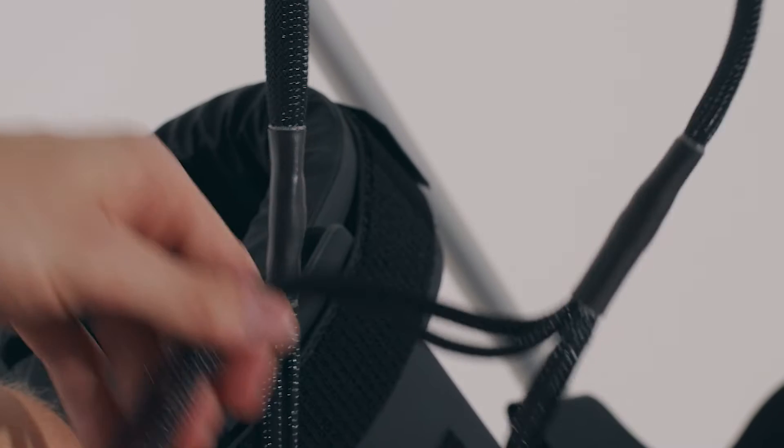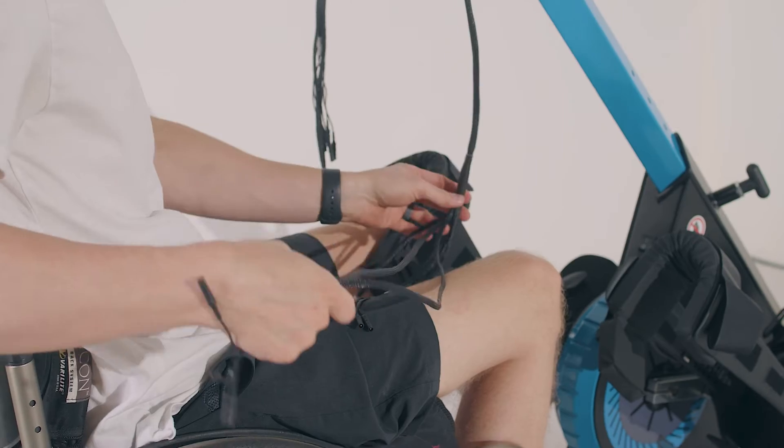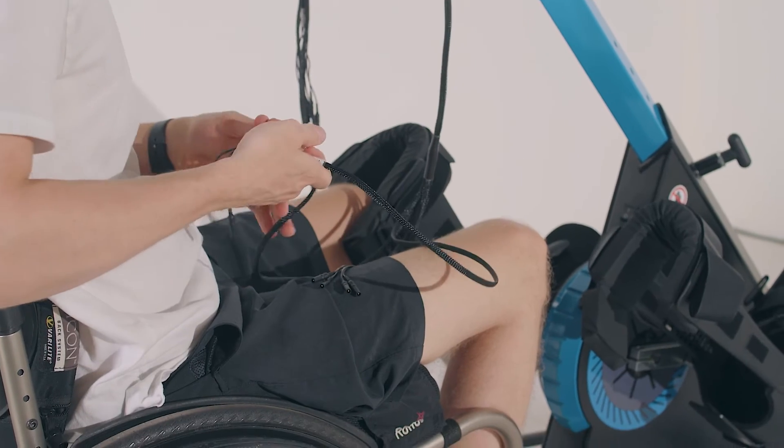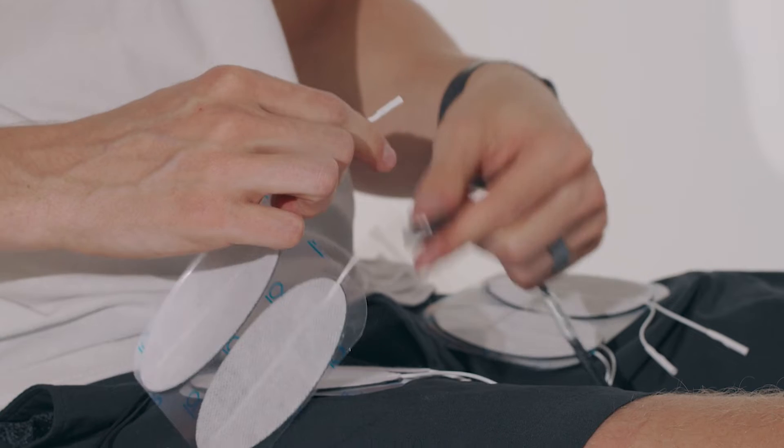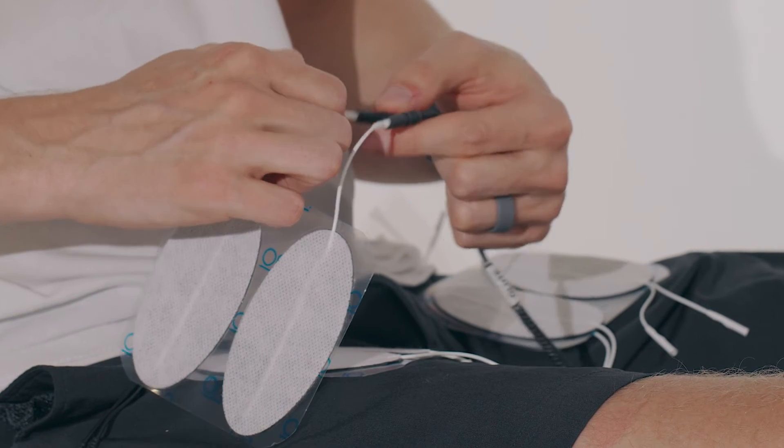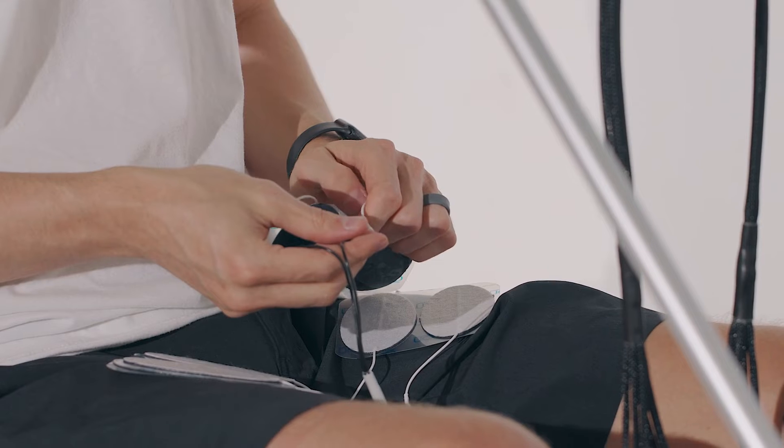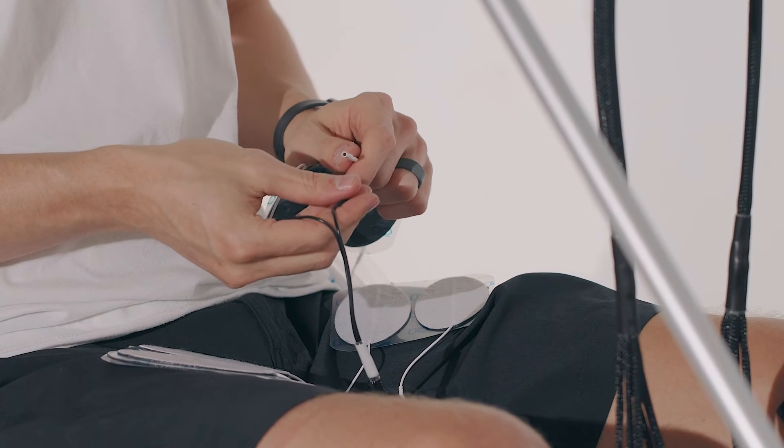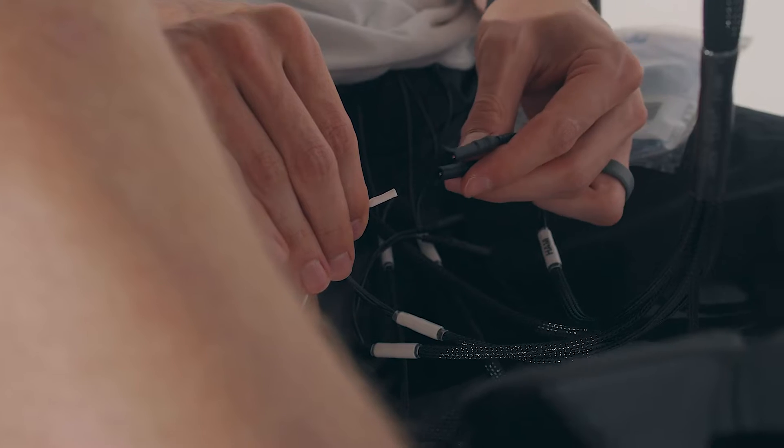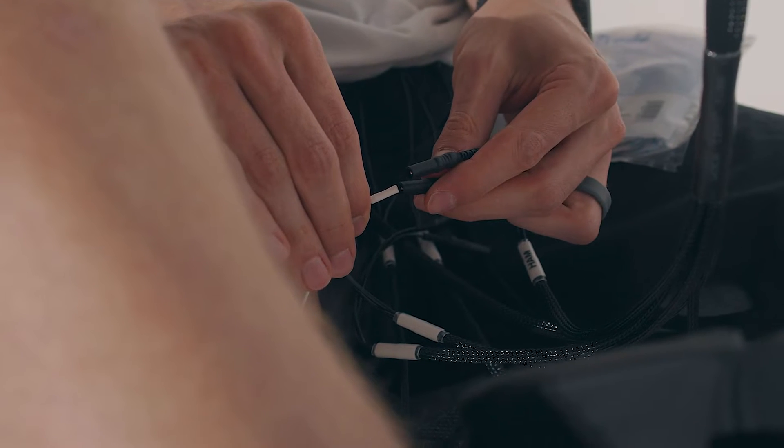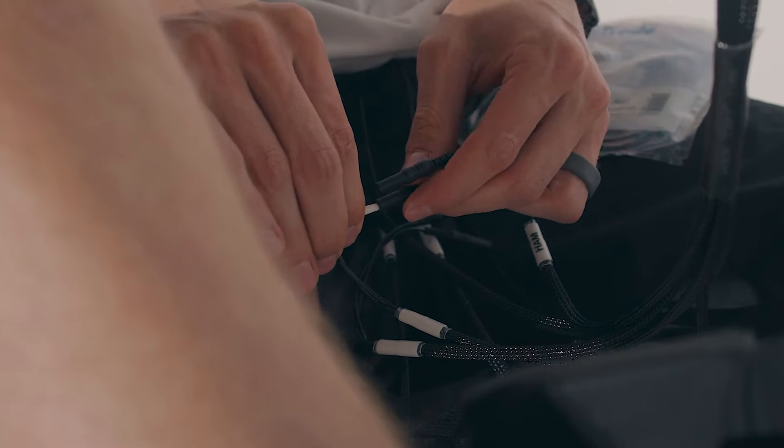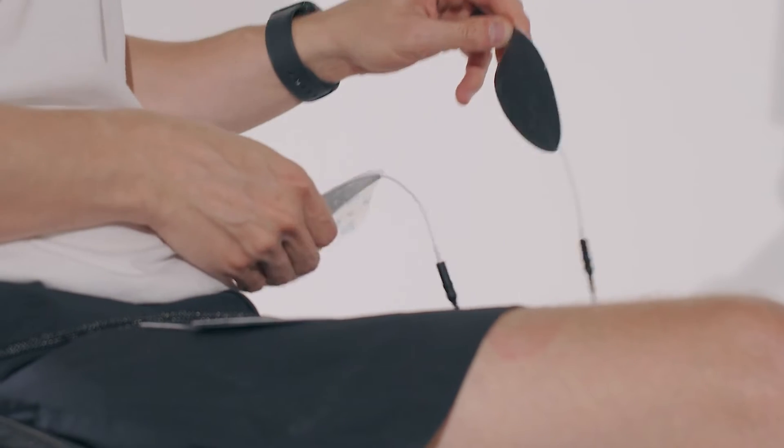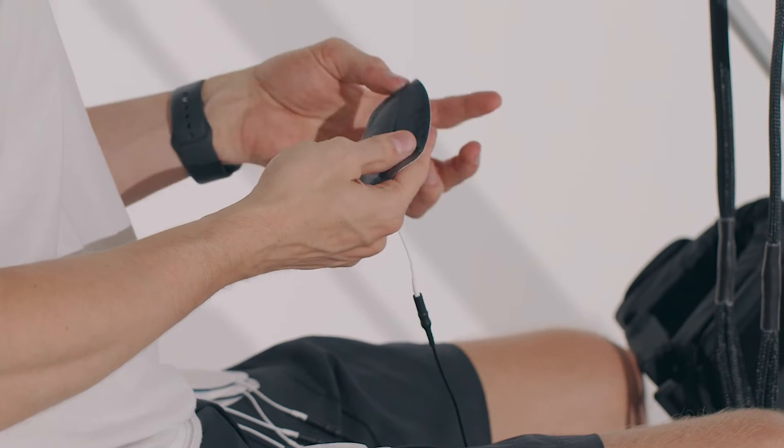The myocycle has two cables that are identical and all black in color. The cable on the left side of the console is for the channels going to the left side of the body. The cable on the right side of the console is for the channels going to the right side of the body. There are two electrodes for each muscle group. For details on electrode placement, refer to the graphic in the user guide.